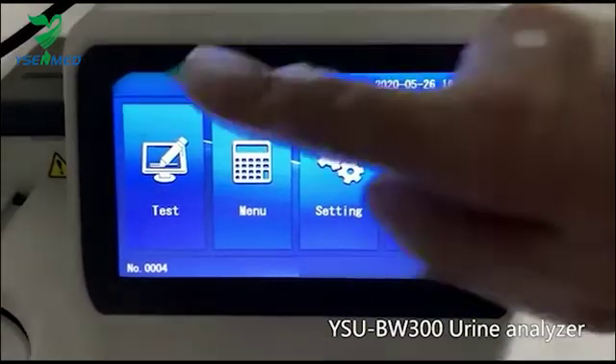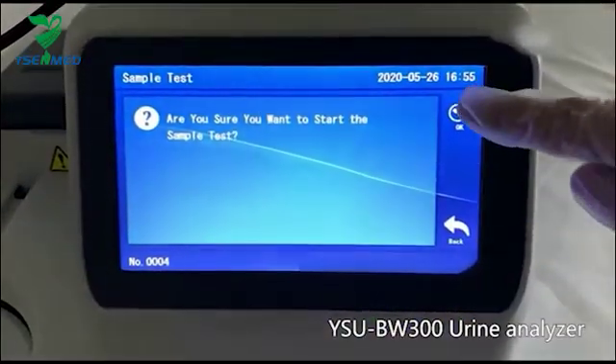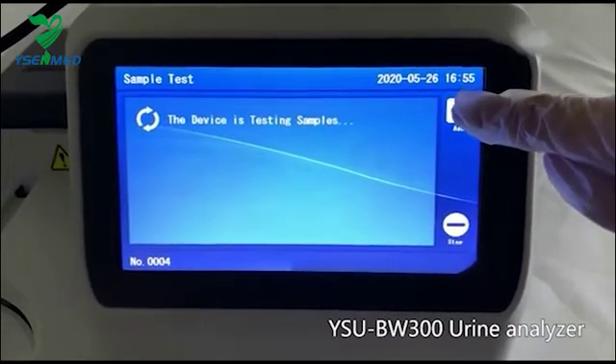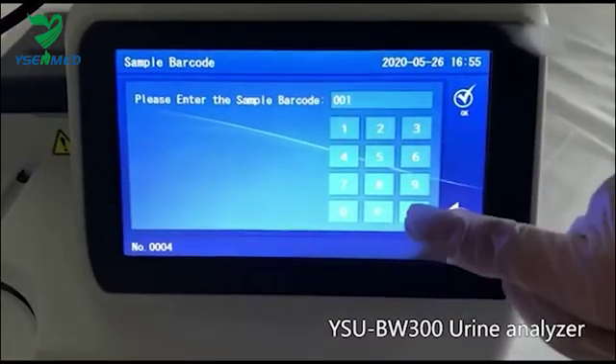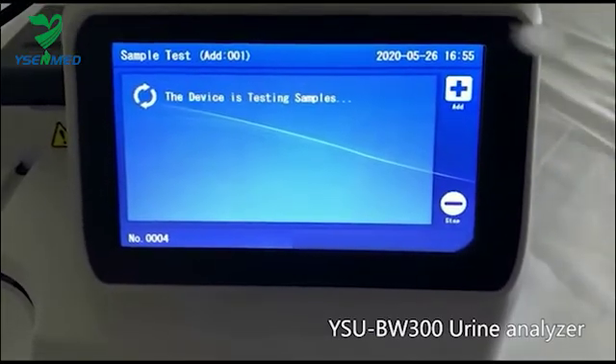For regular tests, press the Test button on the screen of BW300. Click Add. Enter the patient ID manually, then click Add.